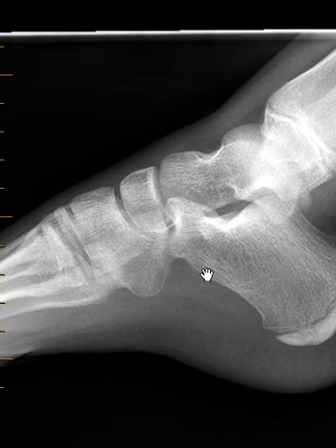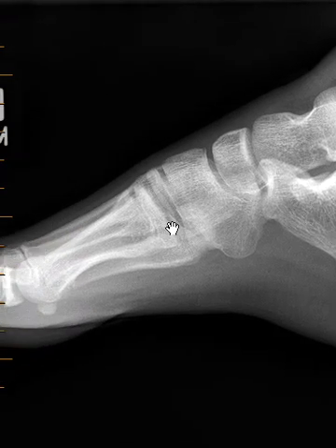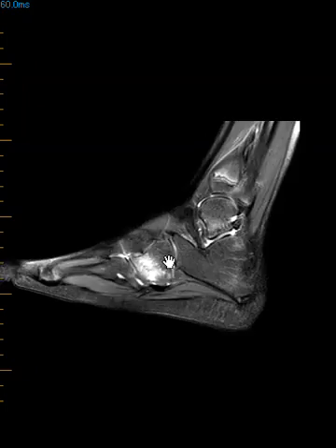That line is a growth plate — it's just normal for this age. We see the cuboid bone, navicular bone, and the metatarsals. All these bones look good, but they decided to do an MRI just to make sure they weren't missing something — and indeed on MRI there were findings.